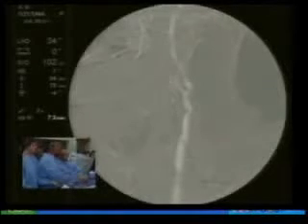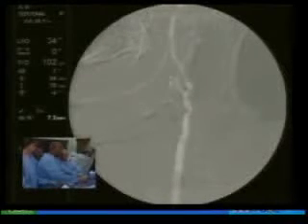So I think it's just a matter of we always worry about shutting off the external carotid. And actually with this system, because the wire is not attached to the sheath like it is with the MoMA device, it's very easy to get in position. But for the amount of time that the carotid is occluded, it is insignificant. I mean, think about what the average length of time is that the carotid is occluded during an endarterectomy in the NASCET trial? 32 minutes. So this is nothing.